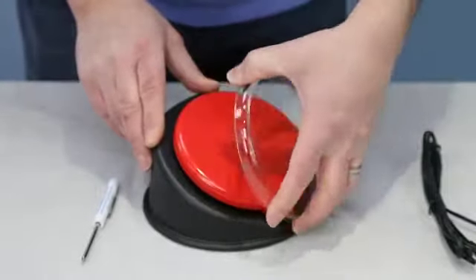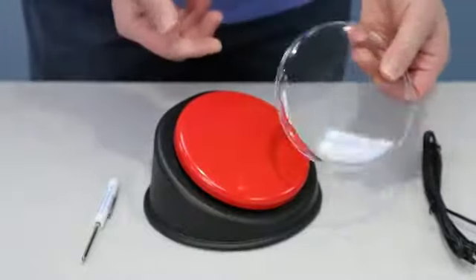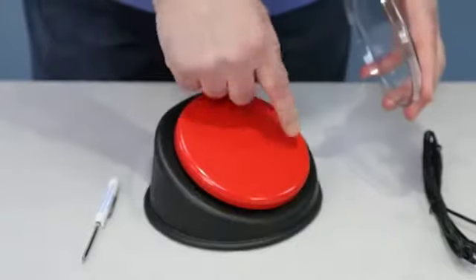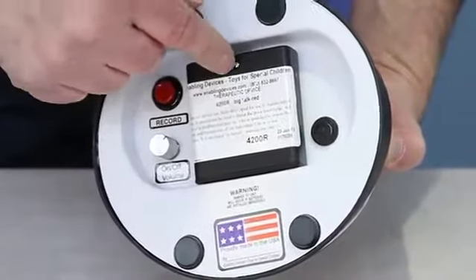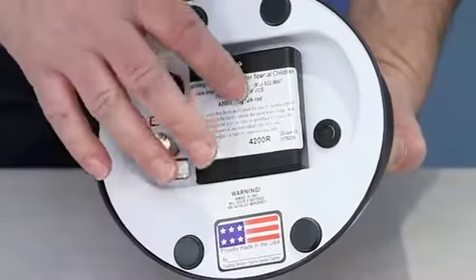The activation area is about a five-and-a-quarter-inch diameter circular surface. It also comes with a clear cover which is removable — you can use it with or without the clear cover. If you use the clear cover, you can put a picture underneath it to keep that in place.